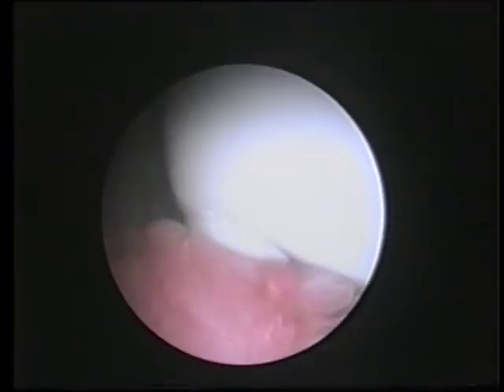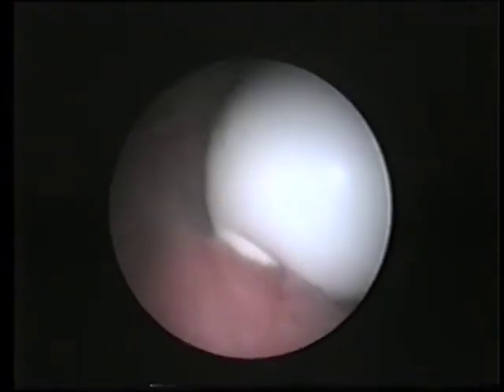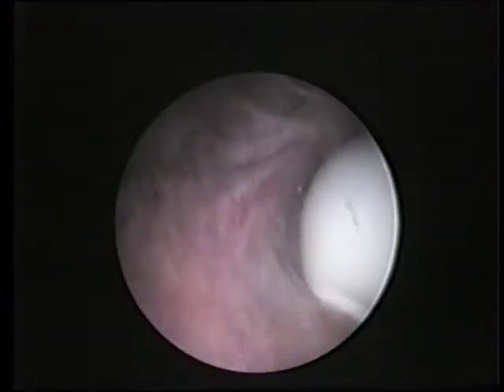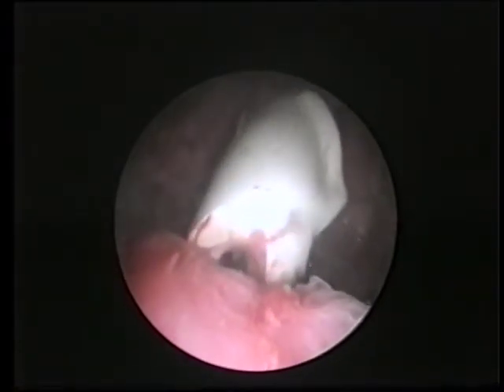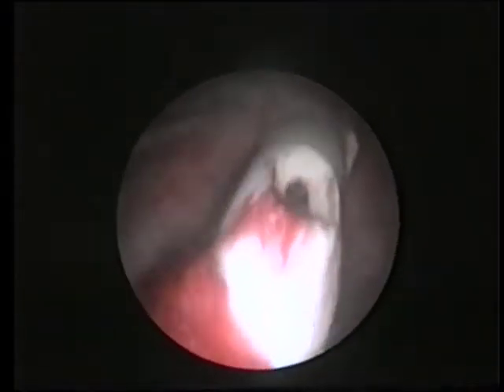When a catheter repeatedly blocks, cystoscopy becomes obligatory. This 85-year-old lady underwent 3 catheter changes in 3 days. Cystoscopy revealed the tip of the catheter embedded in the wall of the bladder, with the eye holes completely obscured. The balloon is deflated, but note how its walls form folds, which can occasionally produce a cuff, obstructing the catheter removal. Gentle rotation can help its withdrawal, and this releases the blood and mucus trapped around its tip.